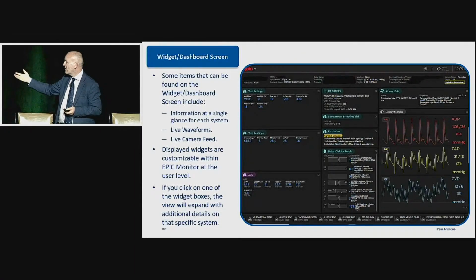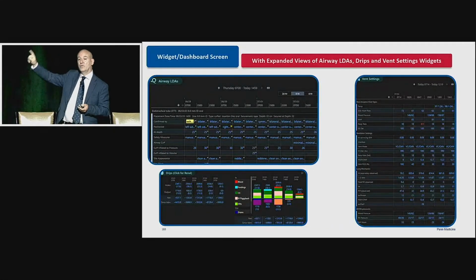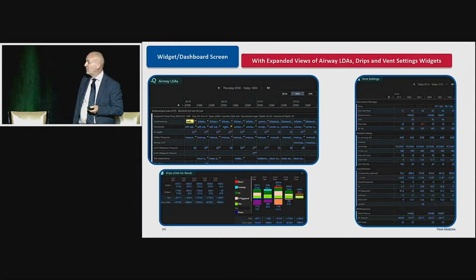It's everything from what type of airway they've got in. Are they ready for a spontaneous breathing trial? Do they need a sedation hold? What's happening to their vasopressors and everything? And then if you just move your cursor, you get a deeper dive, and what automatically drops down is your next sequence. So you can get all the information you need very, very quickly. You can see fluids down the bottom there, and all types of fluid, whether it's TEN, TPN, fluids, or blood.